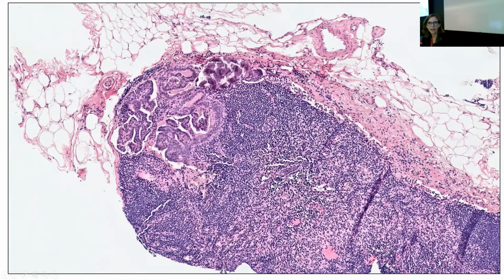And what we had was this epithelial inclusion or proliferation within the node, and this psammomatous looking calcification. Actually, the epithelium looked pretty bland. And so the question was, was it breast cancer within an intraparenchymal lymph node? Was it some sort of inclusion or rest, or was it serous carcinoma?